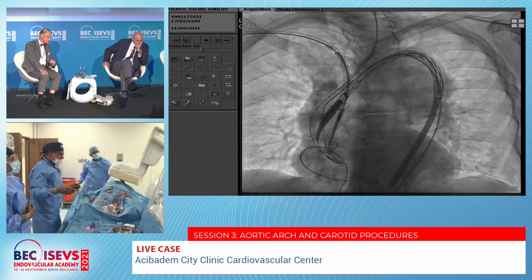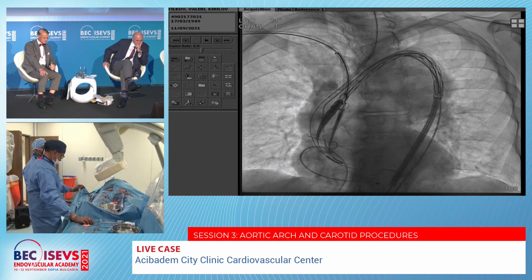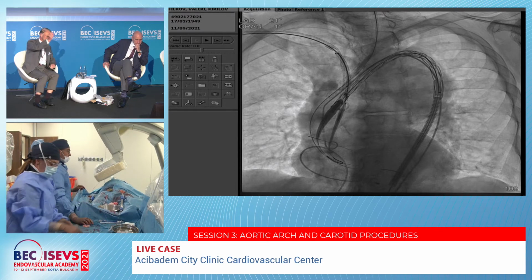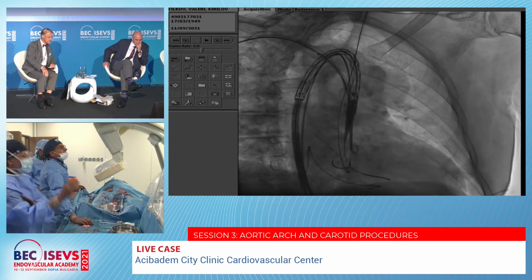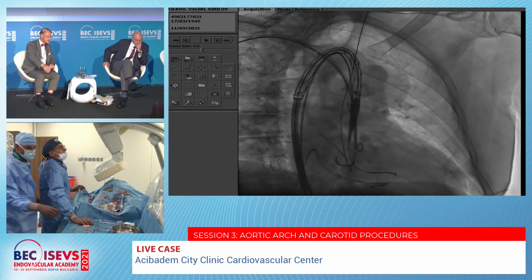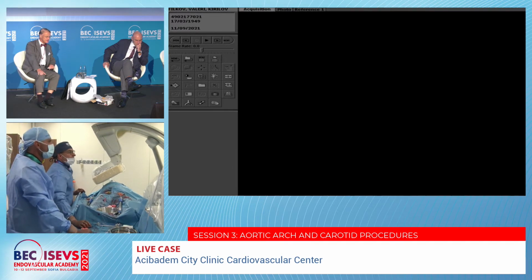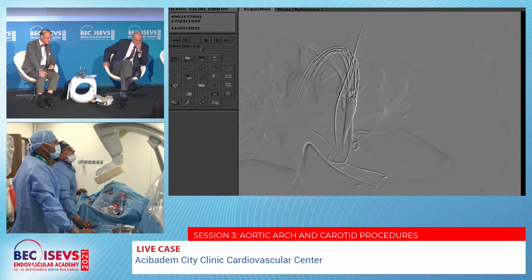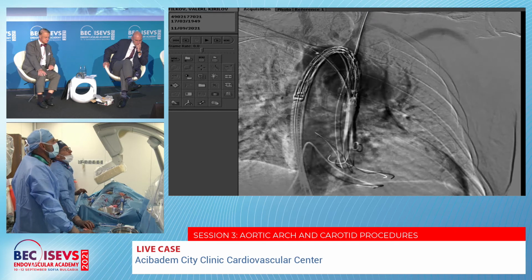collar. But you told us that you will extend the left carotid artery chimney, so to bring it with a second endograft closer to the ascending aorta. Exactly. Absolutely right. We are going to telescope it.